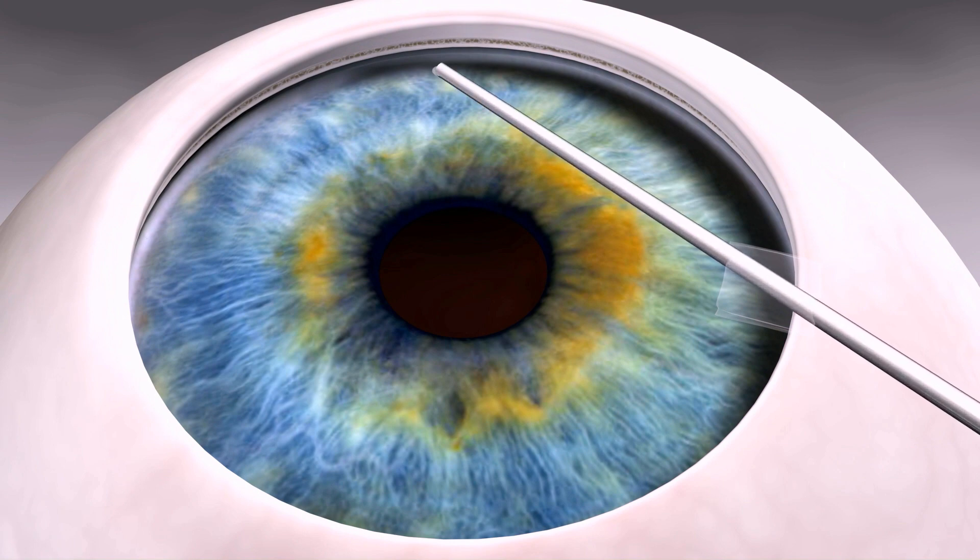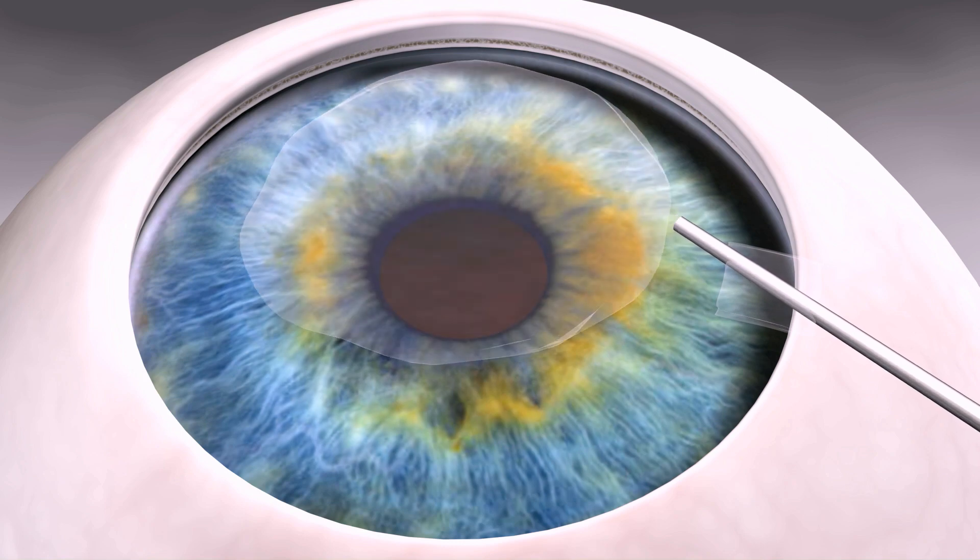Intracameral pupil constricting medications and viscoelastic may be administered to aid in angle visualization and access.